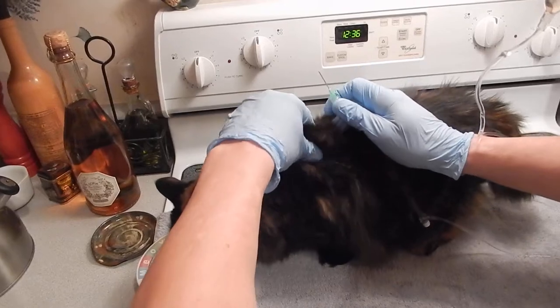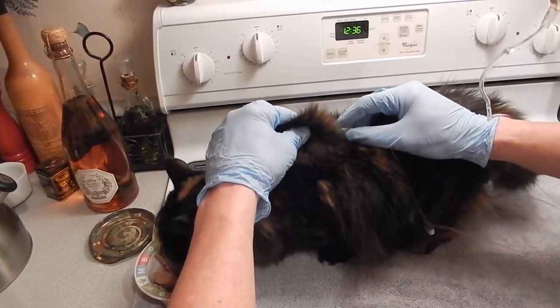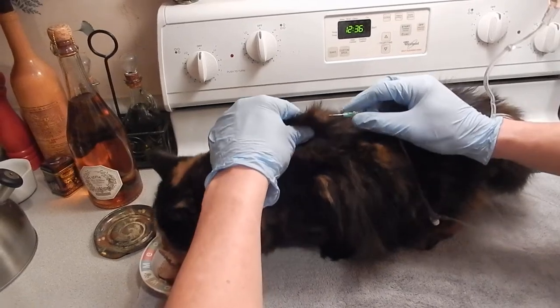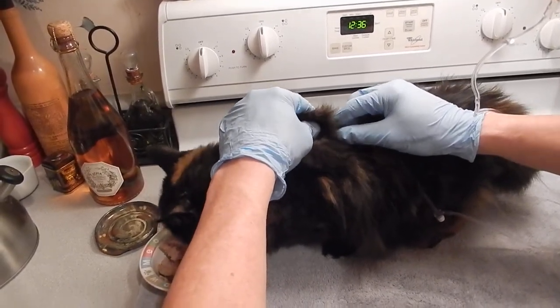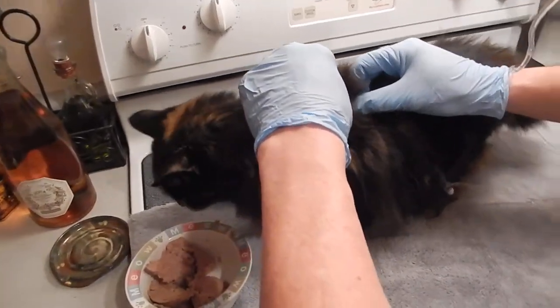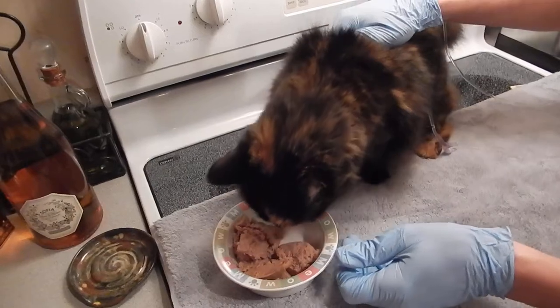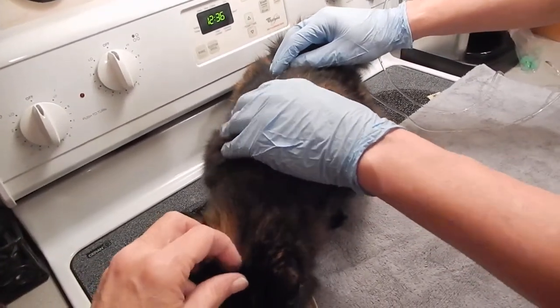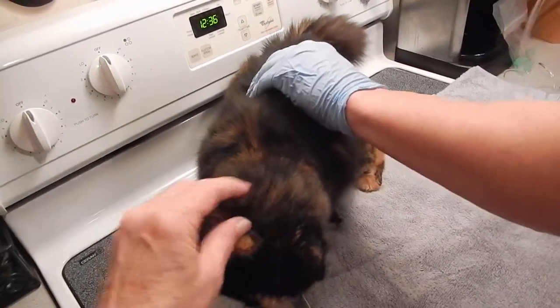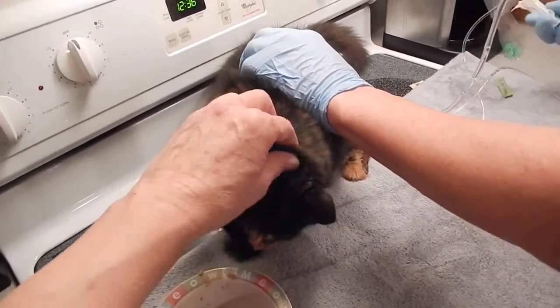I just want to go right above here. Okay, it's okay. There. Good girl. And then Joni's going to — it's all right, I know. And then I'm going to open it up.